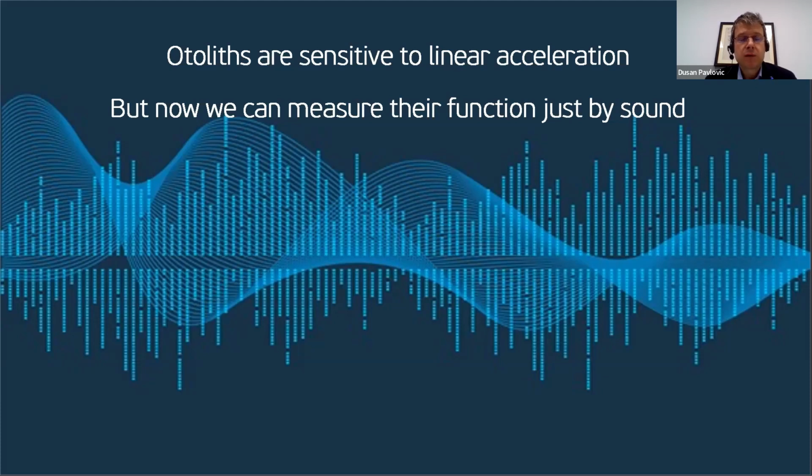All of you are very well familiar with vestibular tests you perform at your office, diagnosing patients with vestibular problems. Most of them test lateral canals, like the caloric test, and other semicircular canals, like the VHIT test.